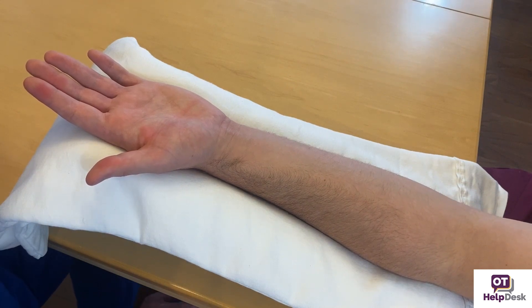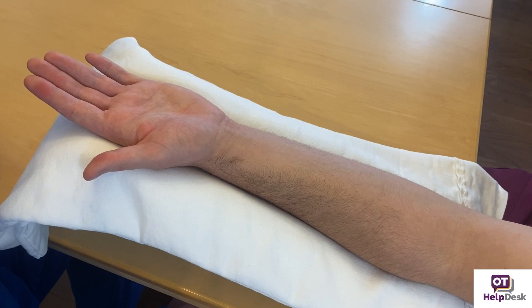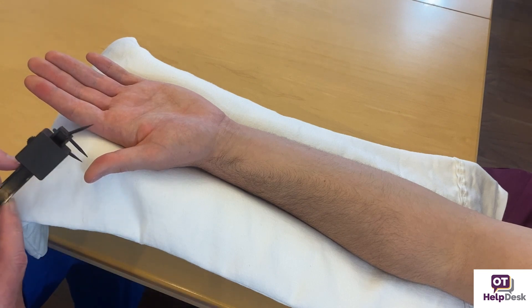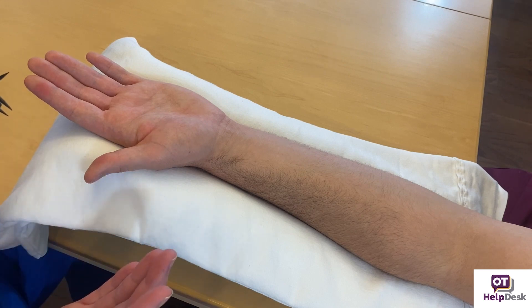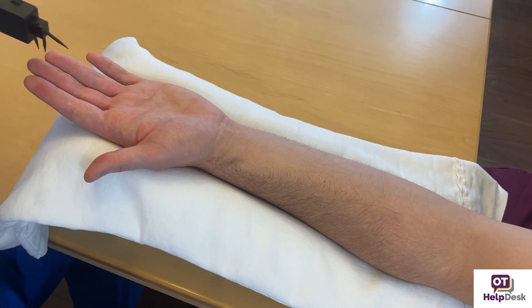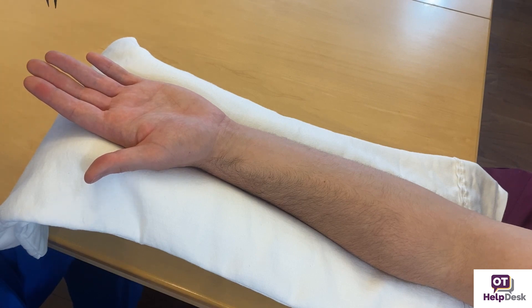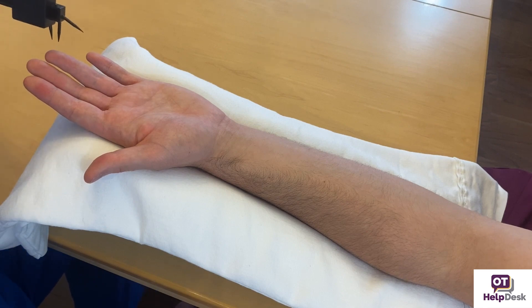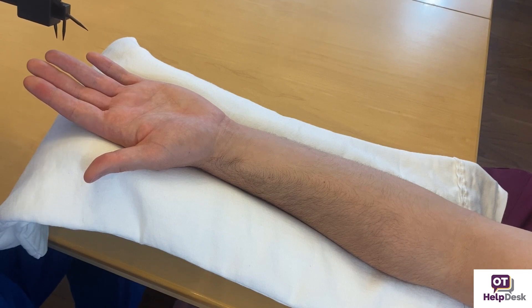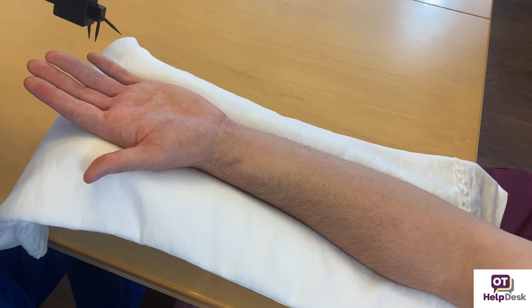We're going to make sure we test longitudinally to catch the nerve especially on the ulnar side. Joseph's vision is occluded. On the median nerve distribution he feels two — accurate. Moving along: two, two, two — and then one. At that point he felt one, which is an inaccurate response. That indicates the ulnar distribution is inaccurate at five millimeters.